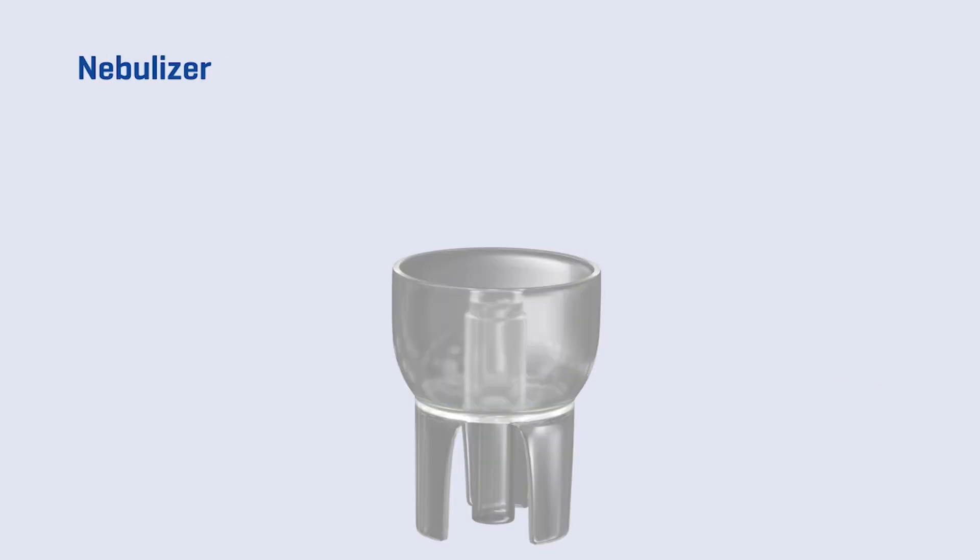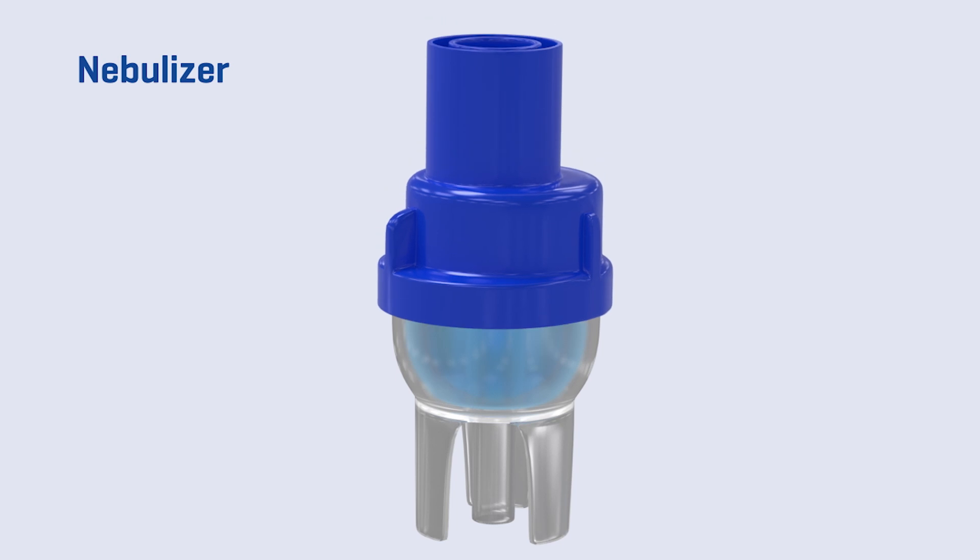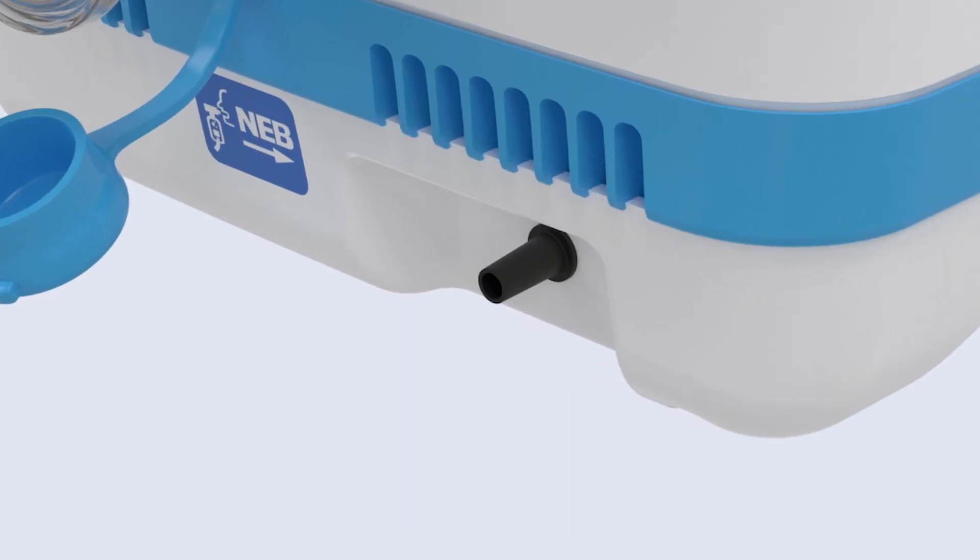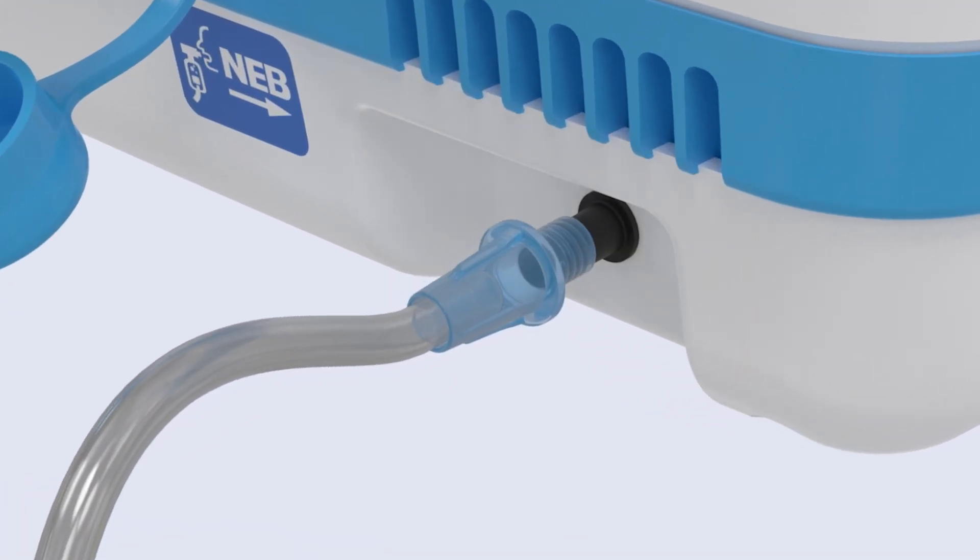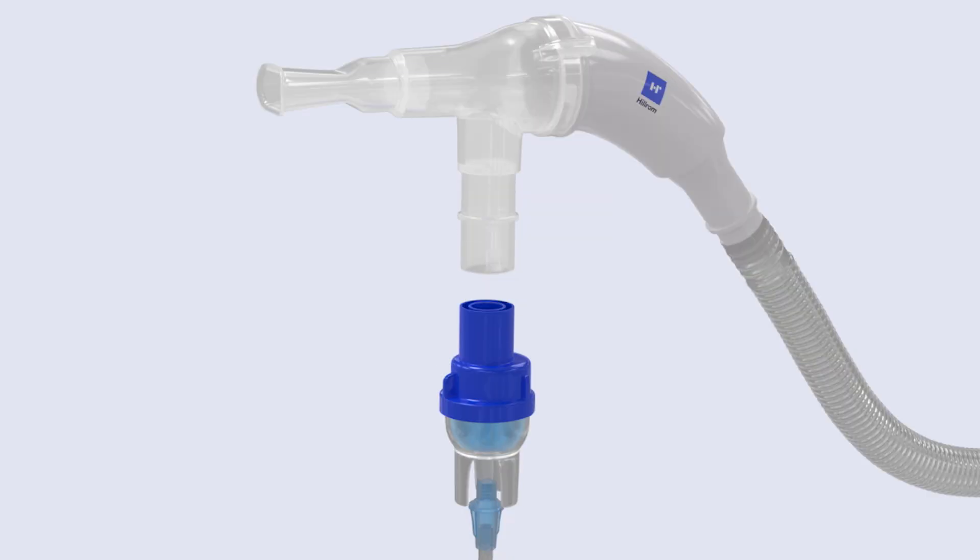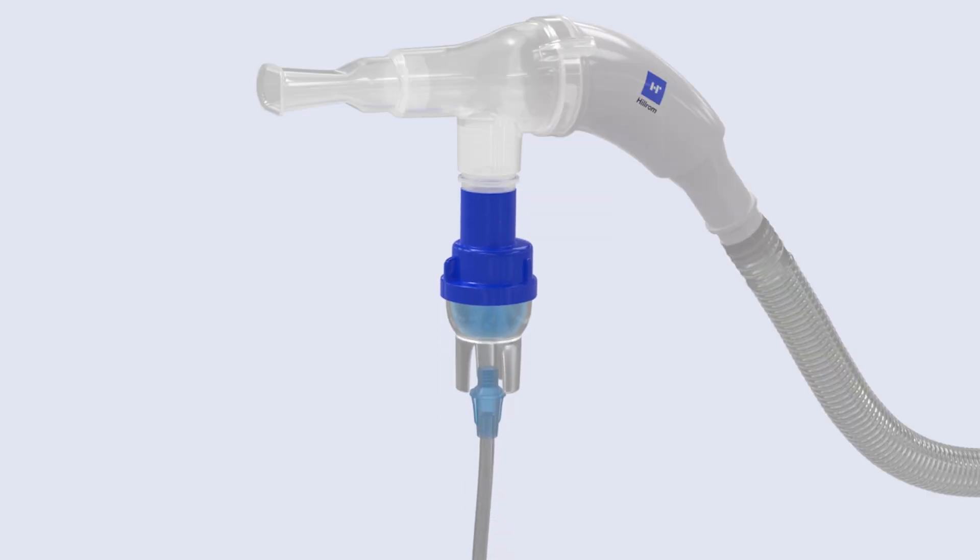When using the nebulizer, fill the cup with the prescribed medication or saline and close the lid. Attach one end of the nebulizer tubing to the control unit, the other to the base of the cup. Use the adapter to connect the nebulizer kit to the patient circuit.